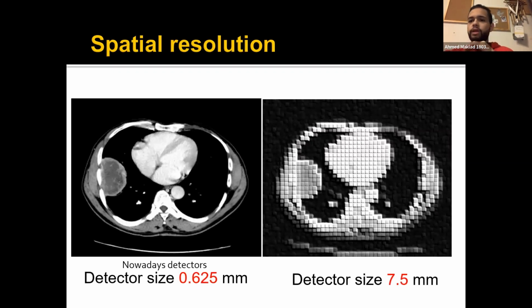Yep, exactly. They have the same thing. You have general and characteristic radiation. It's the exact same radiation you get from an X-ray, all right?